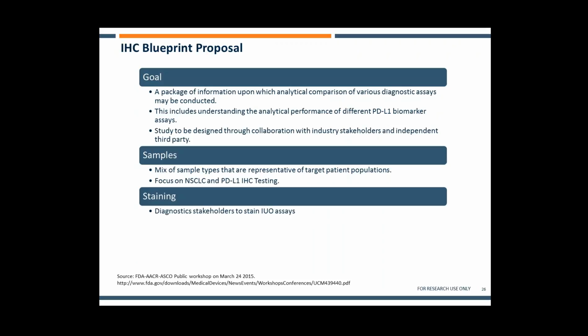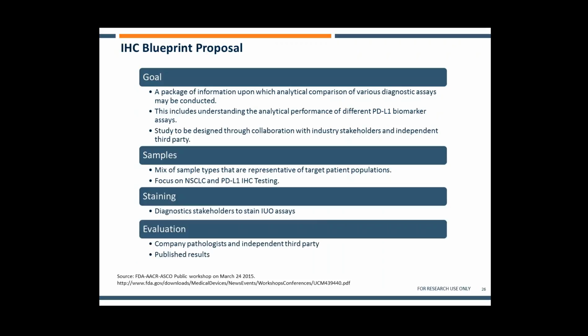The staining will take place on investigational use only assays at the individual diagnostic stakeholders, and the evaluation will take place both by a company pathologist and an independent third party. I think this kind of study goes to show what great research is being undertaken, and Horizon is always a great advocate of these kind of studies, so we're very much looking forward to seeing the results.